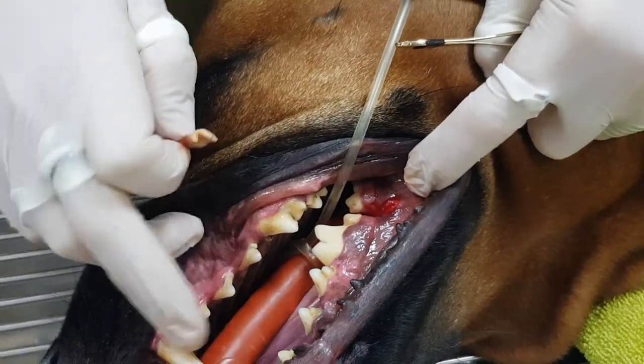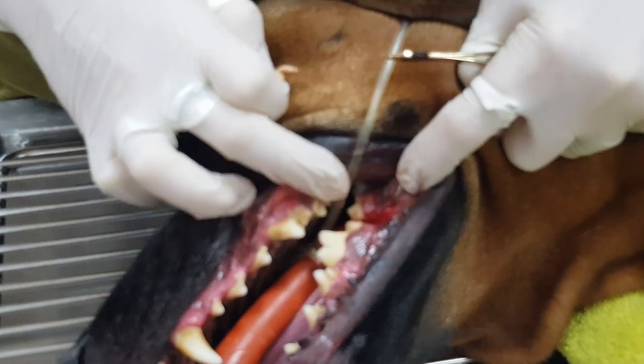You'll notice she's got tartar on her teeth too — we're going to give her a nice cleaning, but she's going to feel a lot better when she wakes up.